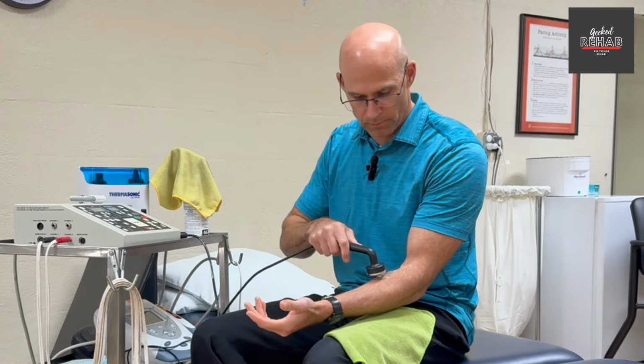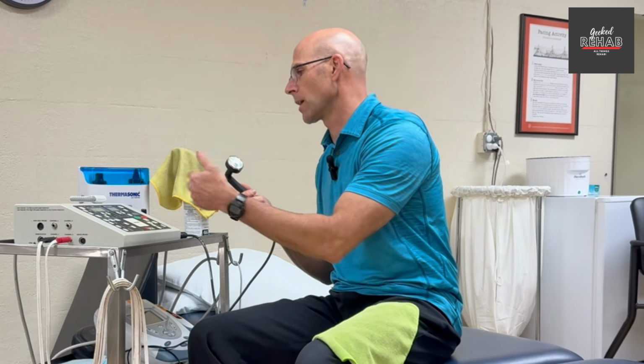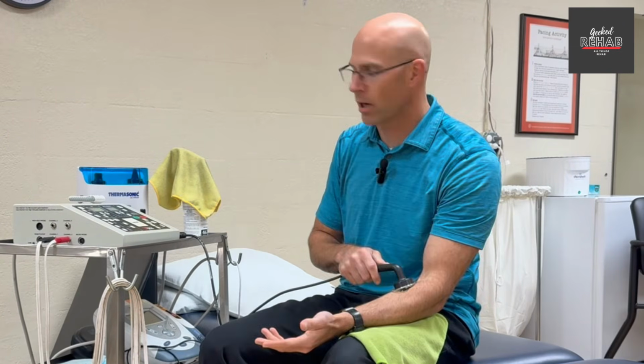I put some gel on there because you don't want to leave this out in the air, because that'll ruin it. So I'm going to turn it up a little bit, hit the setting I want, and push start. If I hold it in one place and I have it on 100%, that heat is going to accumulate in that area and it's going to start heating up the bone tissue underneath. That's not our target.